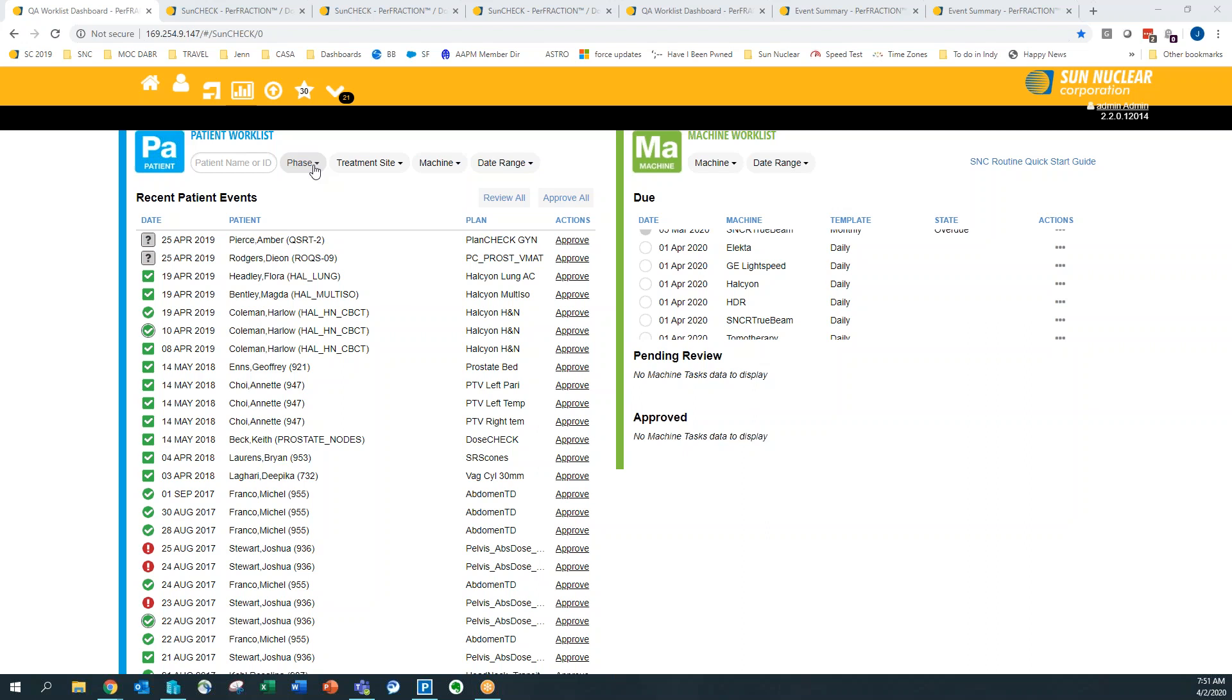The ArcCheck, the IC Profiler, and the daily QA3 in particular. And we will continue to integrate all of our hardware so that you can take real-time measurements directly through this platform.